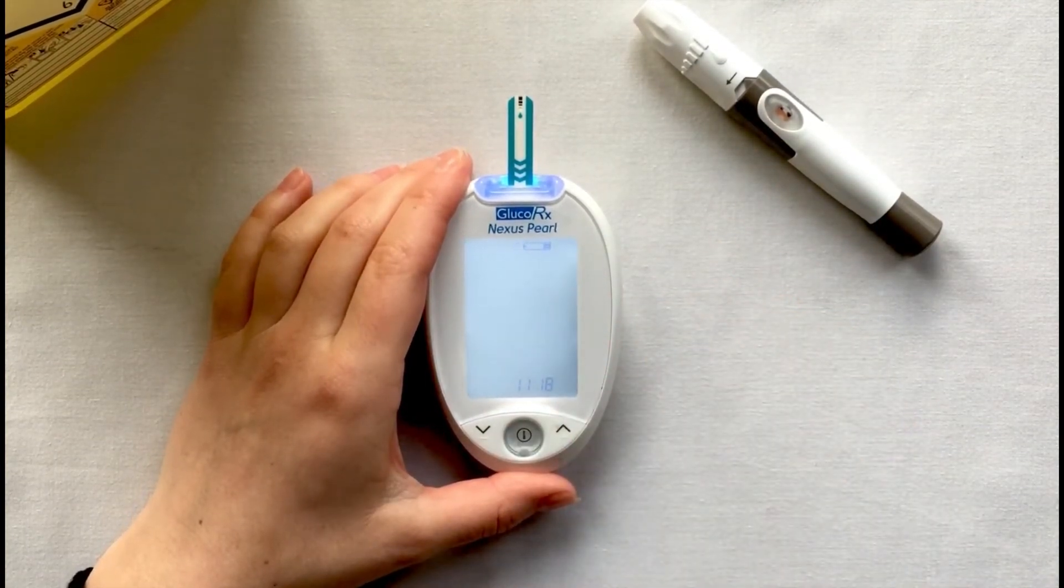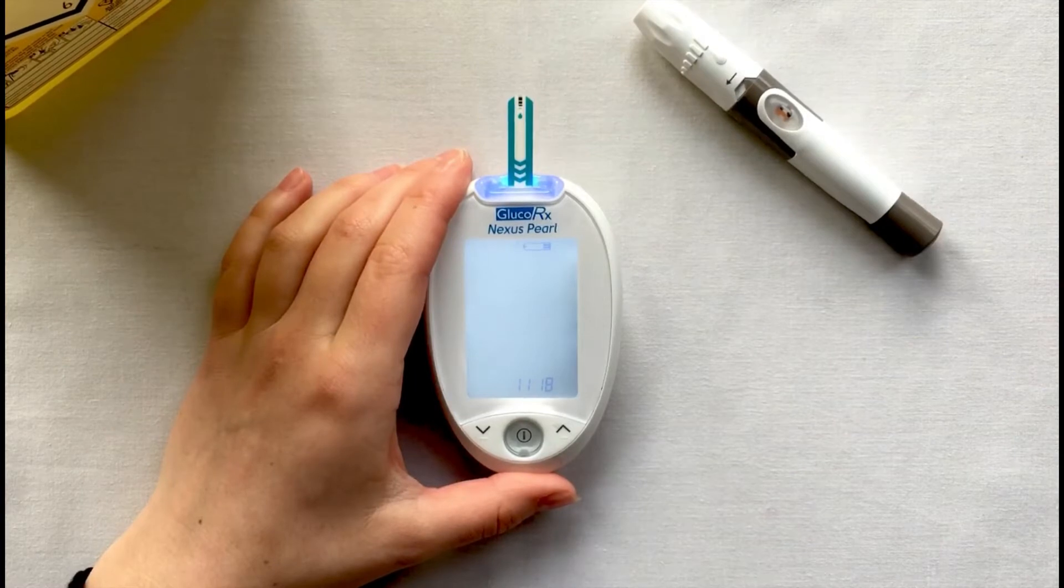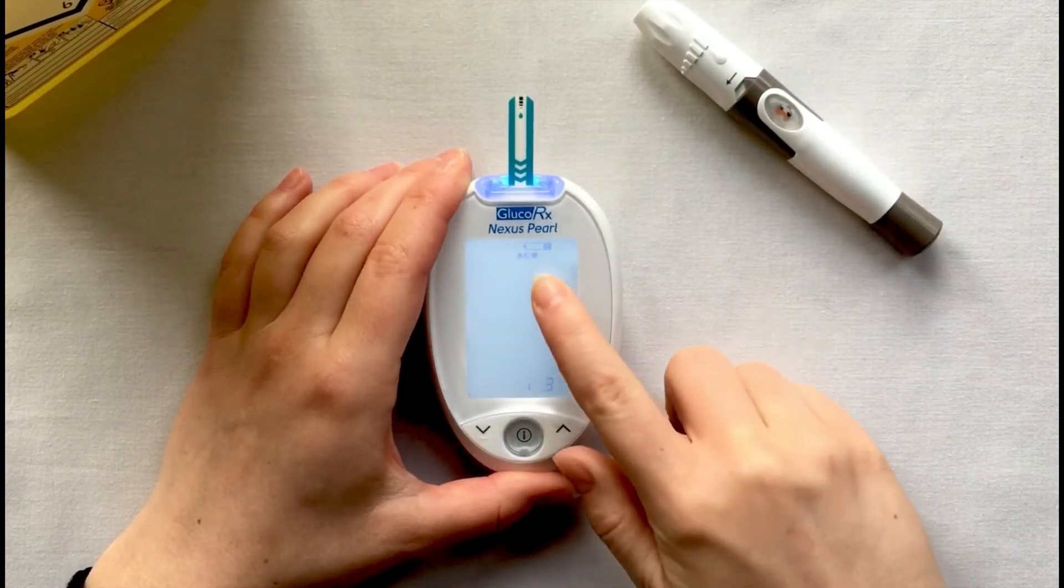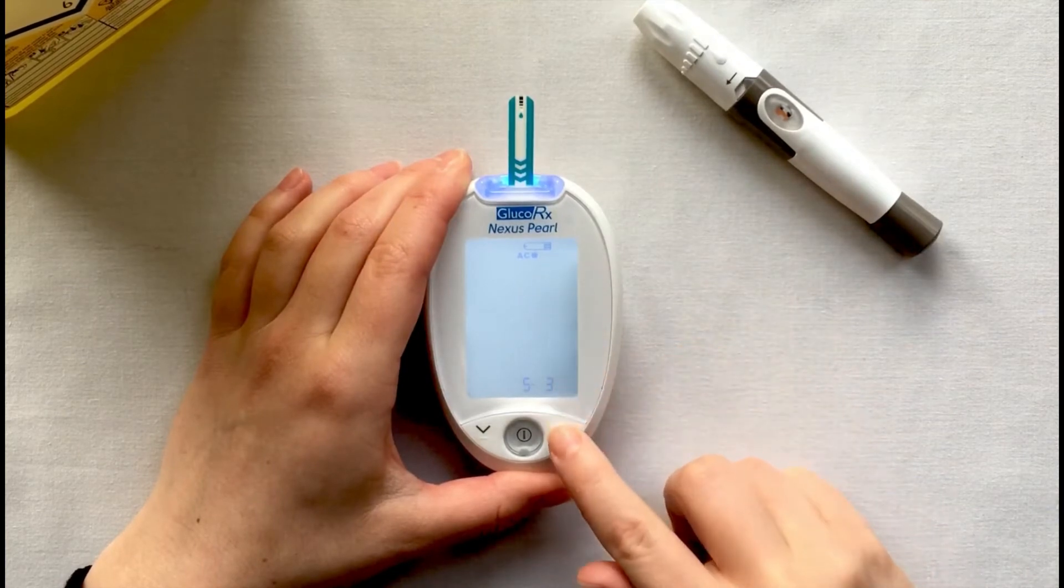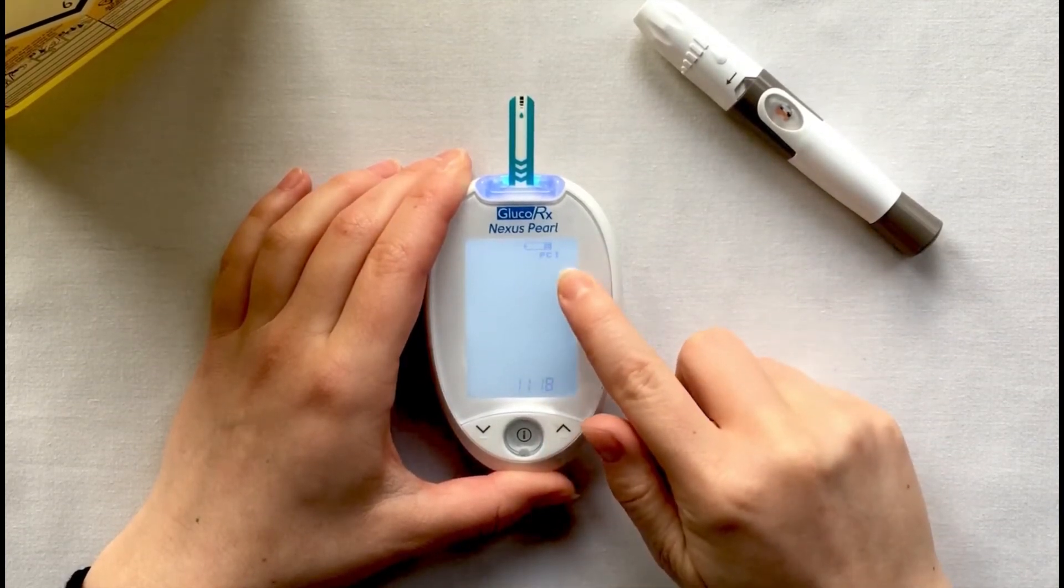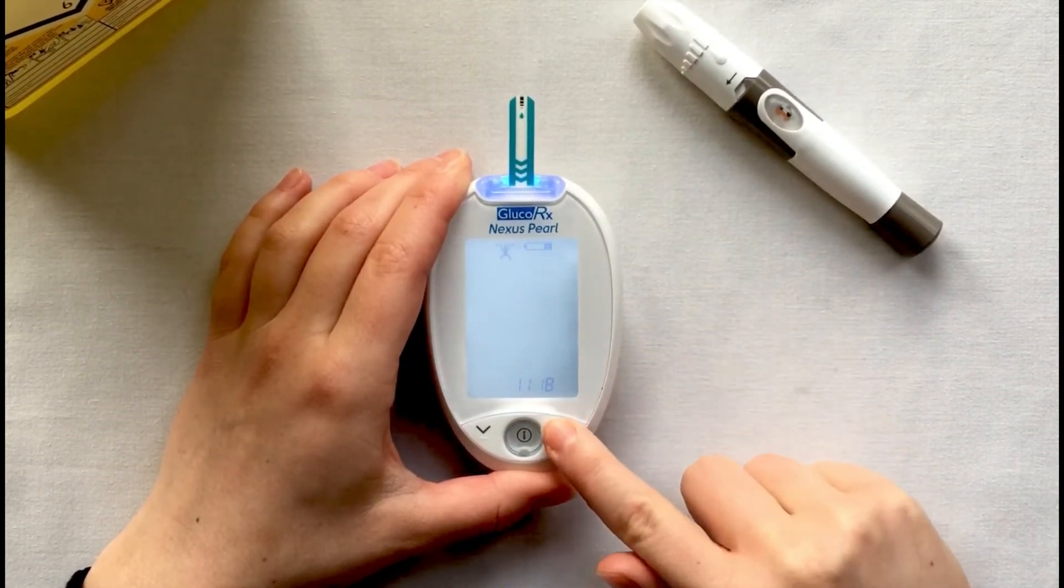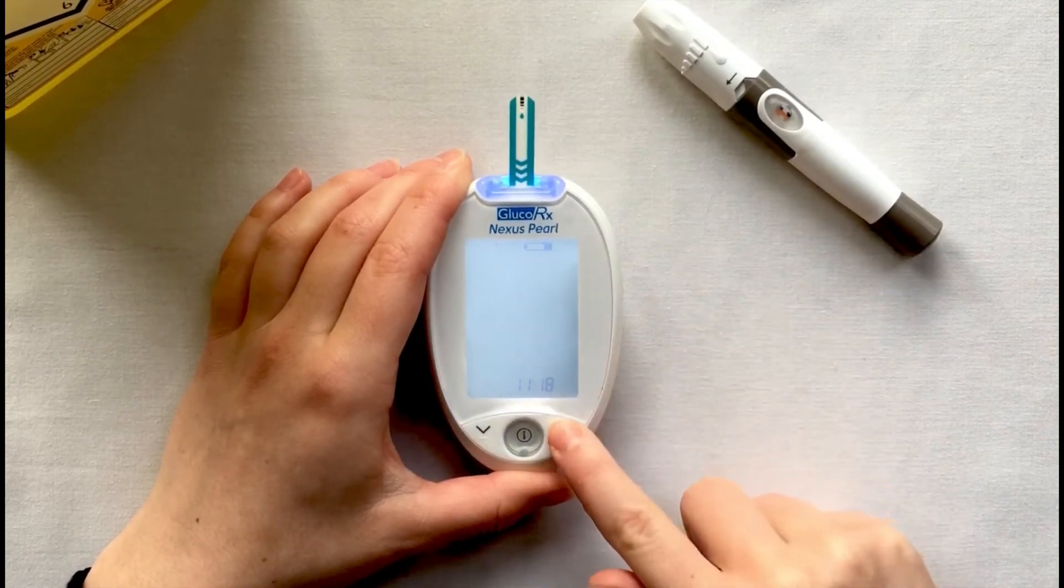Select your measuring mode by pressing the up arrow: general, before meal AC full apple, after meal PC half eaten apple, exercise mode, or QC for quality control test.